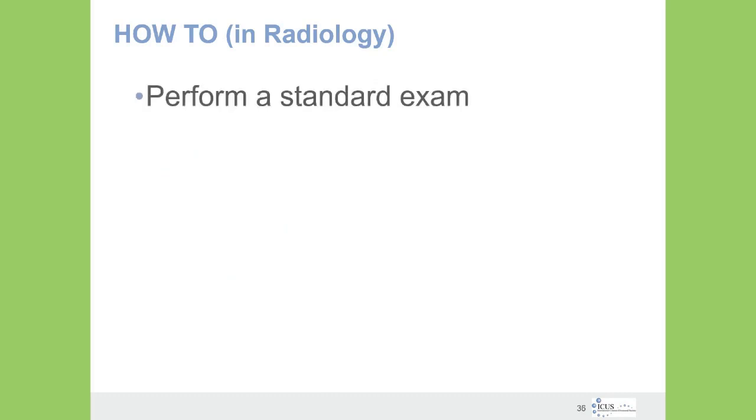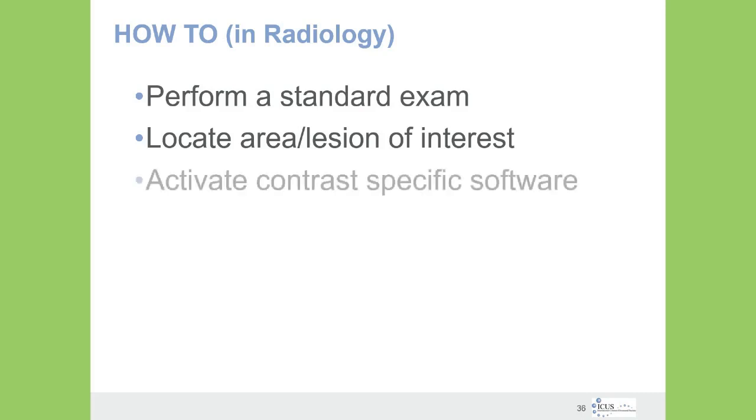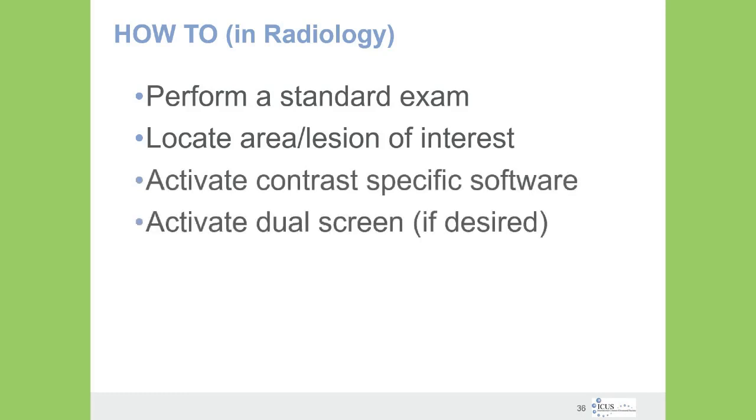We're going to perform our standard exam and locate the lesion of interest. And it is not a bad idea to actually mark on the patient with a marker where that lesion is. So we're ready to do the contrast portion. We know exactly what the best plane will be to image that lesion. We will activate our contrast-specific software and activate our dual screen if we want to.